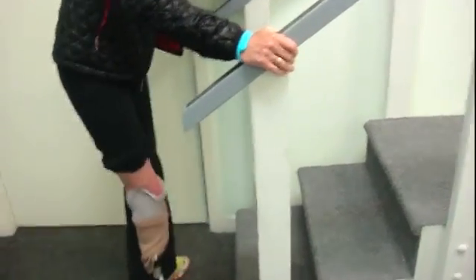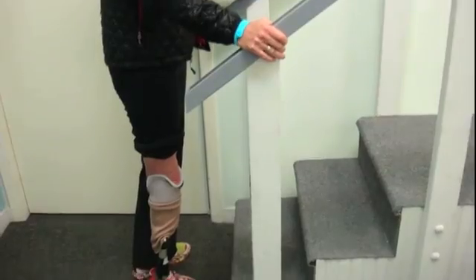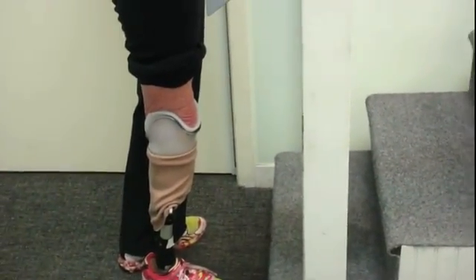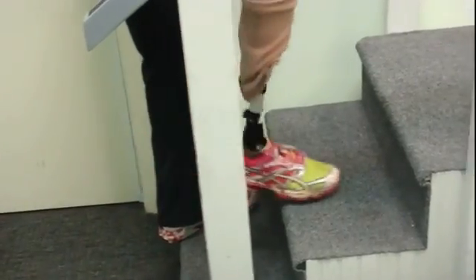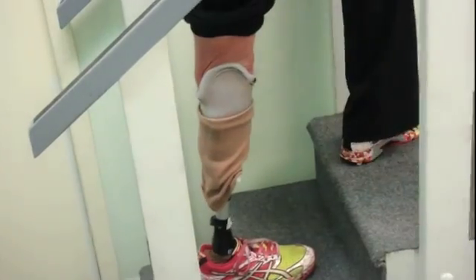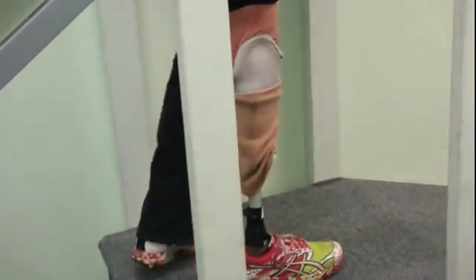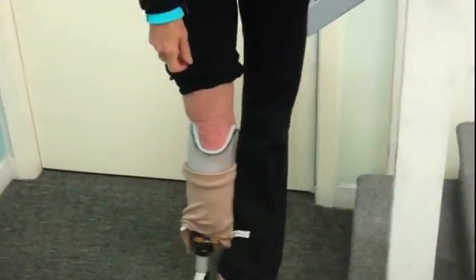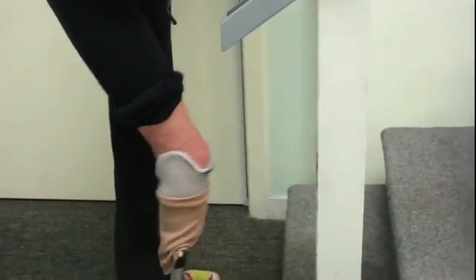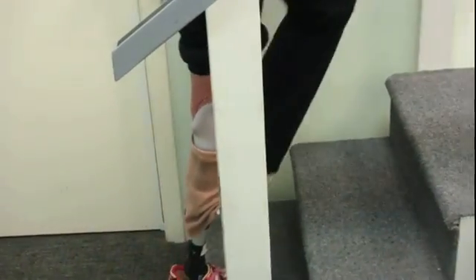Do you feel less restriction on your knee going up and down with this one? Much, much less — there's nothing behind your knee. It's exactly what you always want. You might have reversed that little sleeve when you tried to force it off. Something feels a little bit off. I think you might have pushed it off, forced it off.